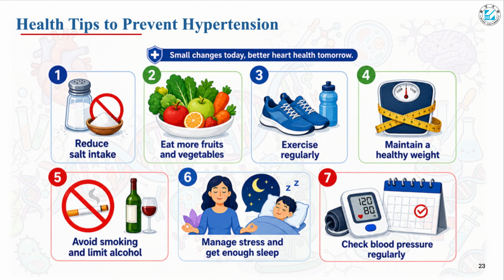In summary, blood pressure measurement is a simple but very important clinical skill. Blood pressure reflects the pressure inside the artery. Accurate measurement requires correct posture, correct cuff placement, and careful technique. Hypertension is common but also has no obvious symptoms in the early stage. However, if it is not controlled, it can be harmful to health. Therefore, learning how to measure blood pressure correctly is important, not only for clinical practice, but also for personal and public health.